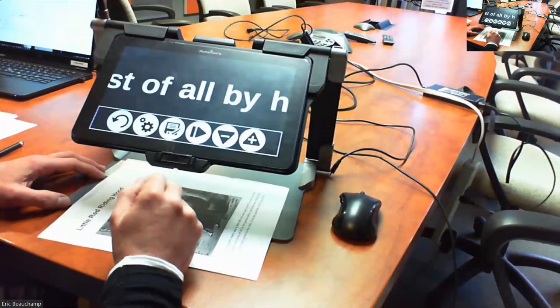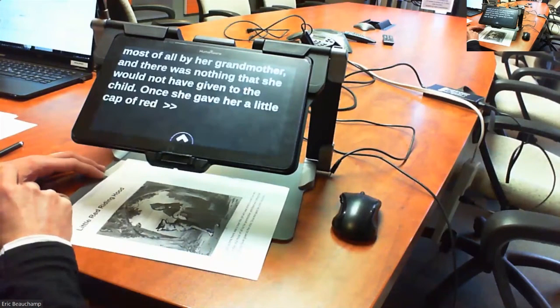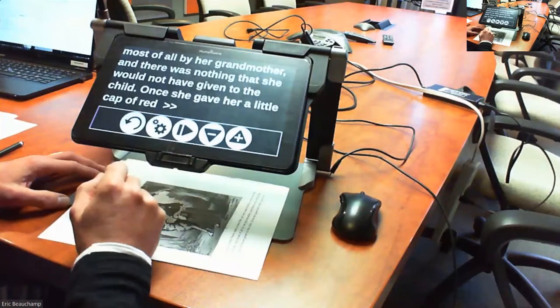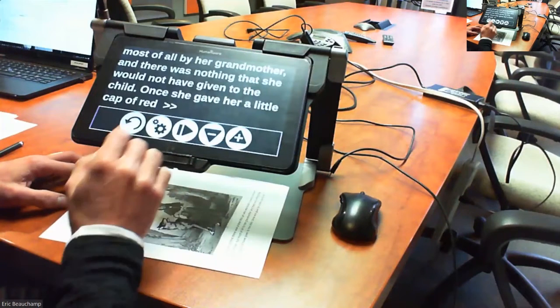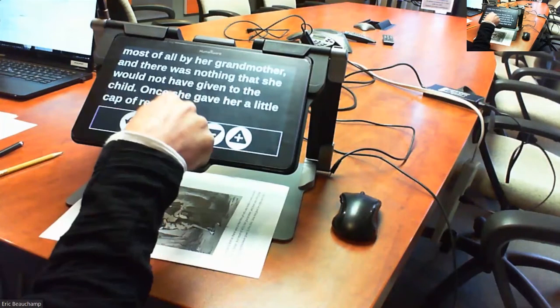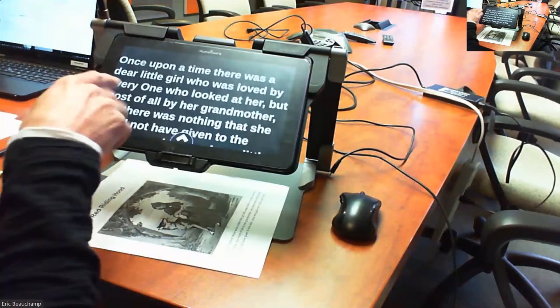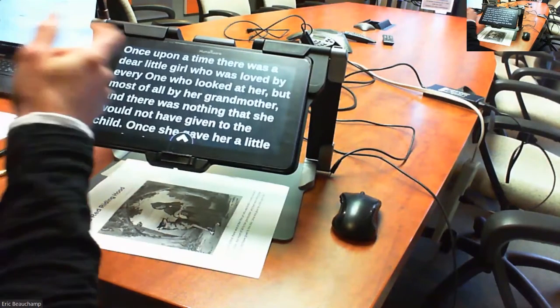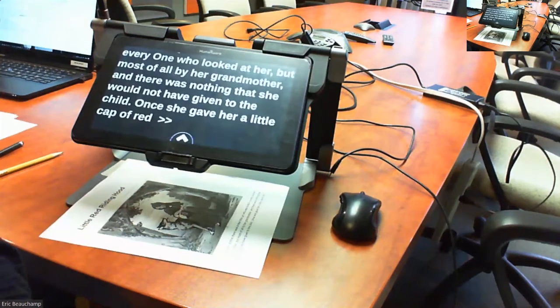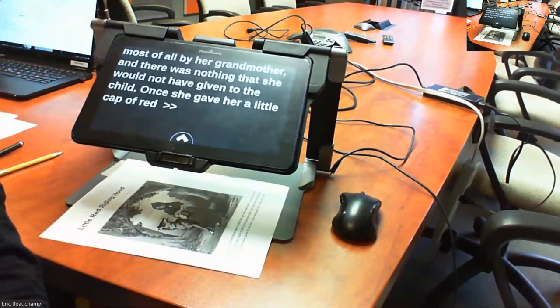I can save that image for later, where I can start reading it wherever I want just by pressing and holding a word, and it's going to start reading. But I deactivated my speech. When speech is off, it's going to scroll through and let the student read, so you can have your student without that audio feedback all the time. I see students being a bit lazy when they have the audio and just listen to it. Have your student read the text instead.